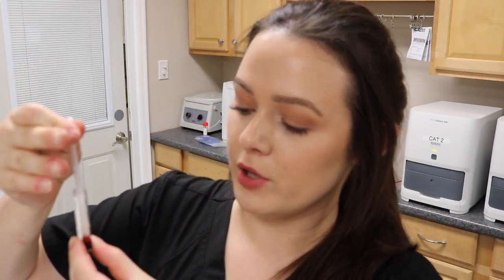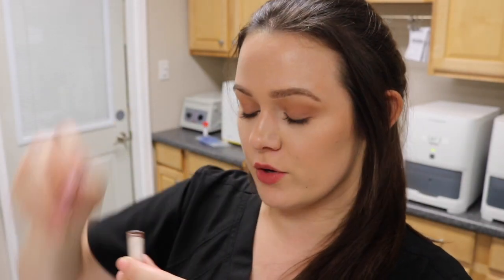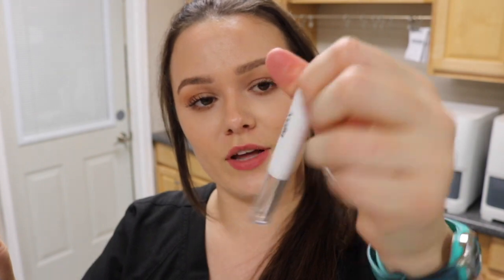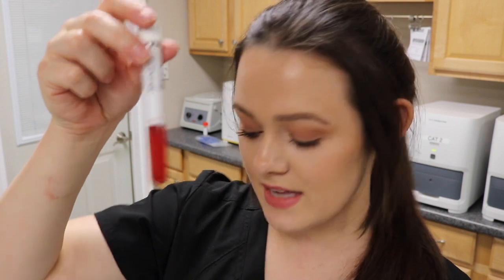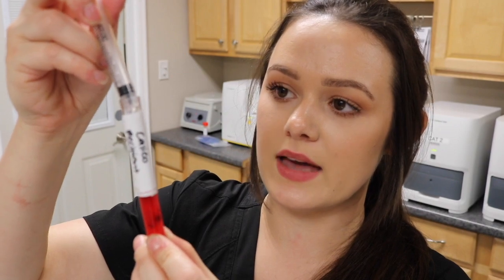I'll put the recipient drops into a clean test tube labeled recipient. Then I'll repeat the same process for the donor — two drops of the donor packed red blood cells into a clean test tube labeled donor. I have two syringes filled with exactly three mils of saline, and I'm going to add that to both samples and mix them gently.